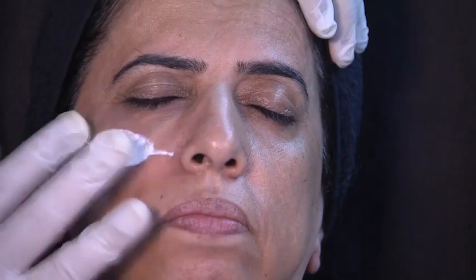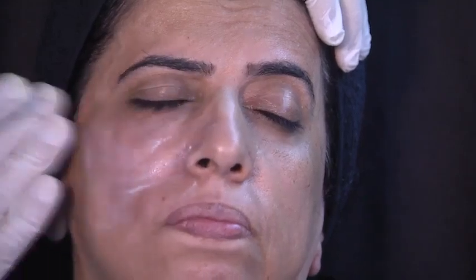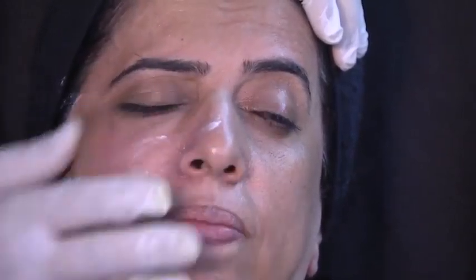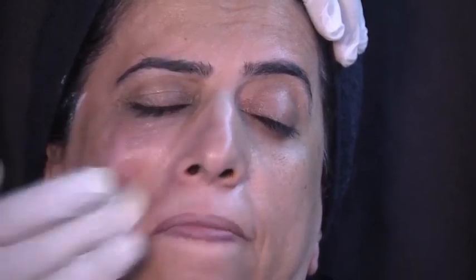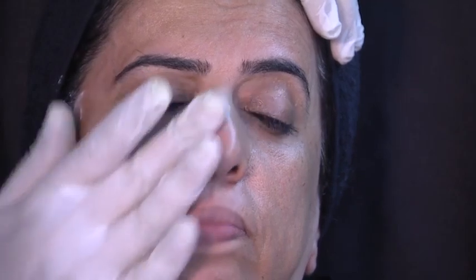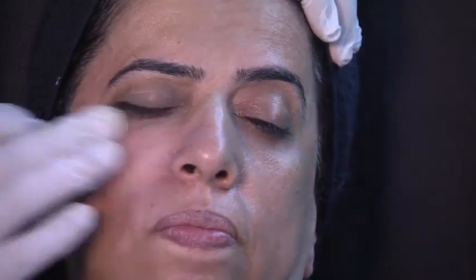Little bit of cream to mold, Vicky. And I finish there. And now I do a drop in the surface. But in this case, she has such a thin skin that these are the cases where we have to be careful if we do a superficial deposit, because a little bit of water retention could also be visible. So when they have such a thin skin, I prefer not to do the superficial deposit until they come back and I explore the possibility of water retention in the deep layer. Sorry about that. It was a little bit too much cream.